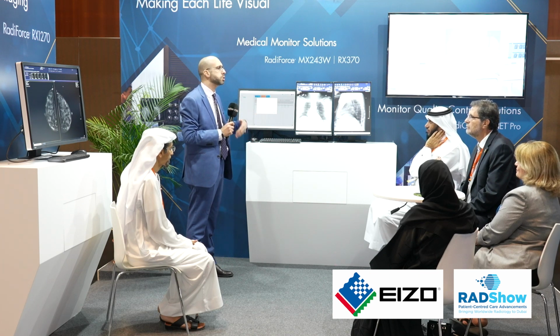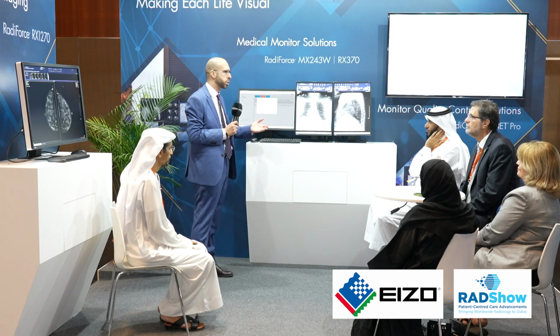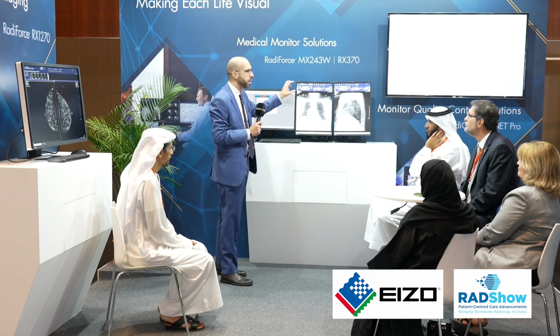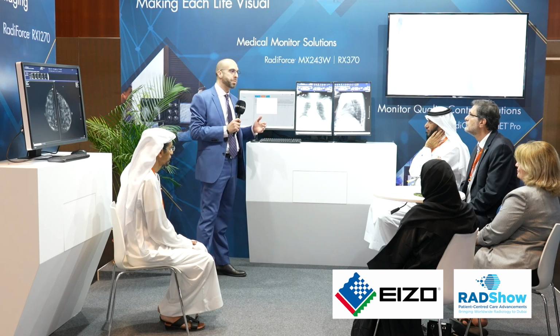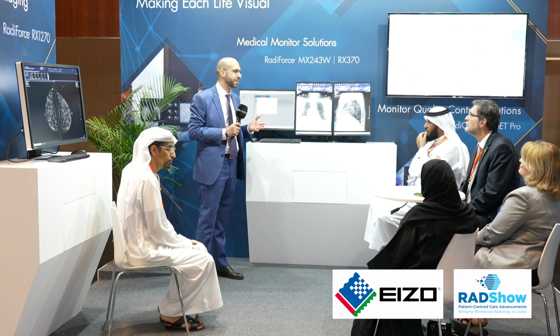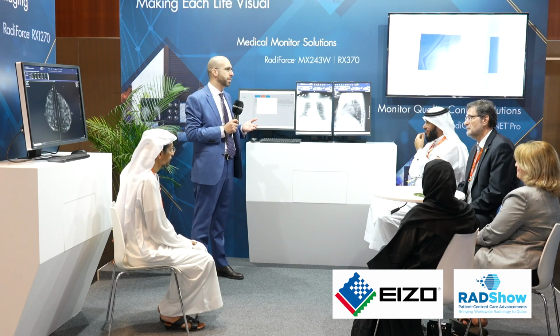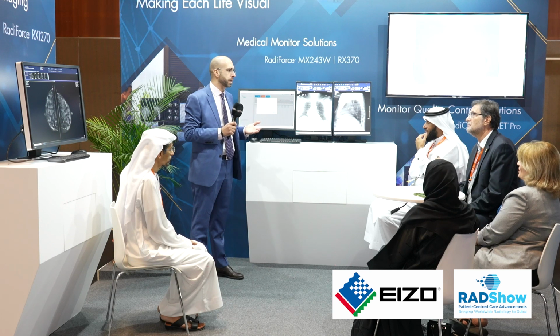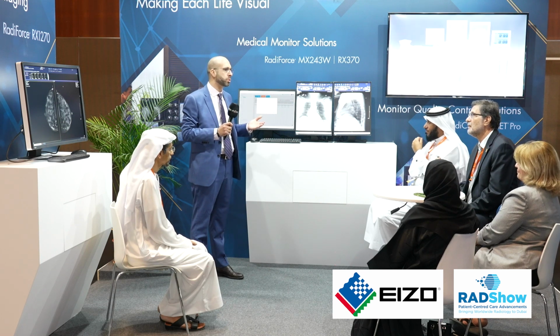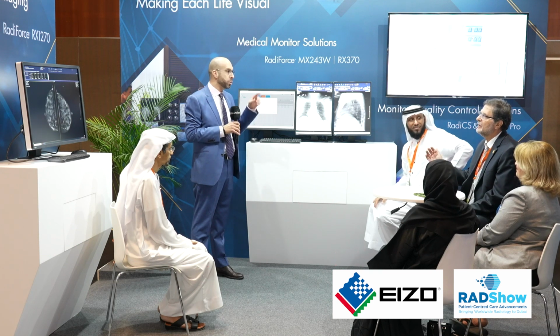And there are additional tests that need to be done, not only the calibration. You have the uniformity test to check the uniformity on the screen. And sometimes there are daily tests that the user should do, but unfortunately no one is doing it because it's time consuming, and the doctors will not. Maybe at night time. But the user should do it.